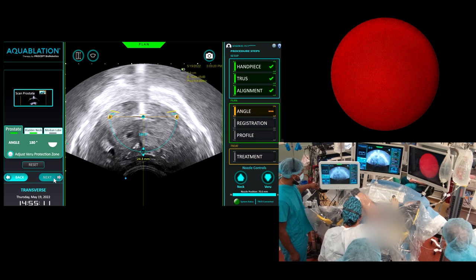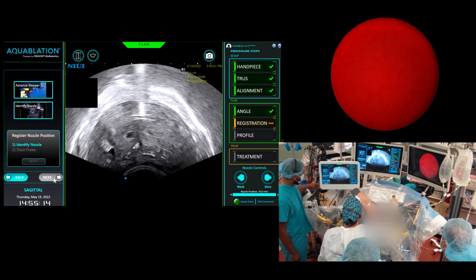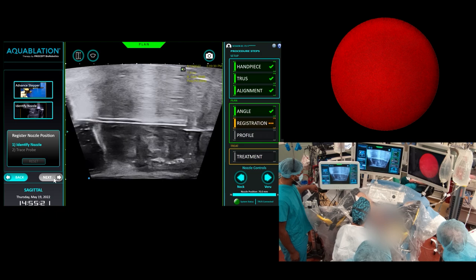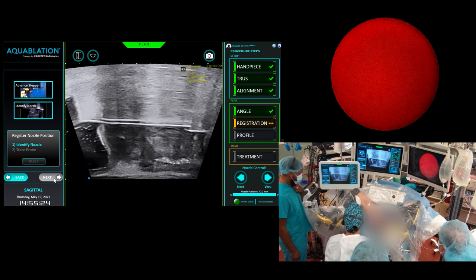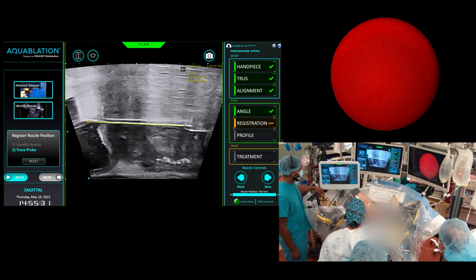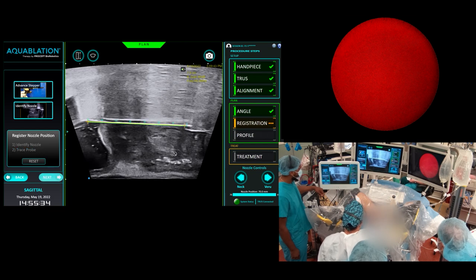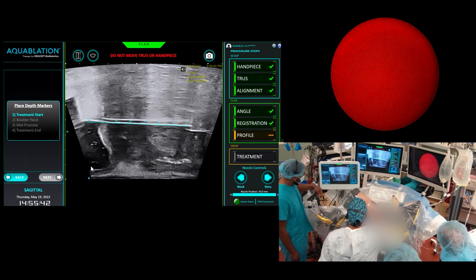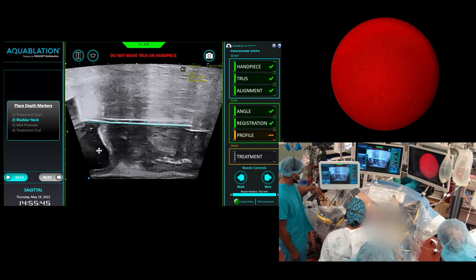Should we do the median lobe? I don't really see it. You're perfectly aligned with that urethral cliff, so that's good. Nice frosting. Yeah, you can see it right there. I know you're squirting the water jet in the black, just to see where the nozzle comes out. And here's my depth markers. Let's go outside — and bladder neck. I think that's bladder neck there. And then I would say mid-prostate's probably right here. That's a huge prostate. And that's my end.